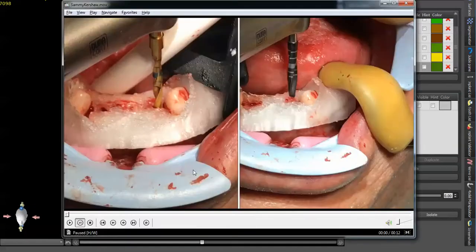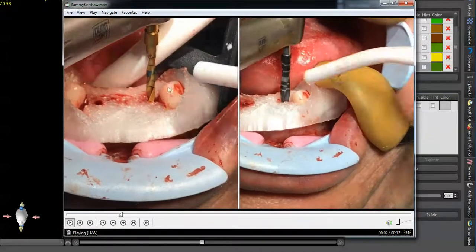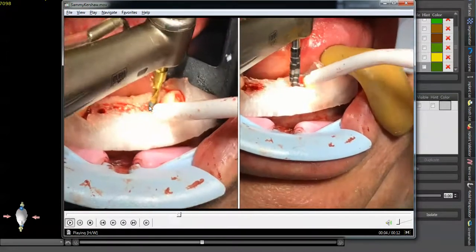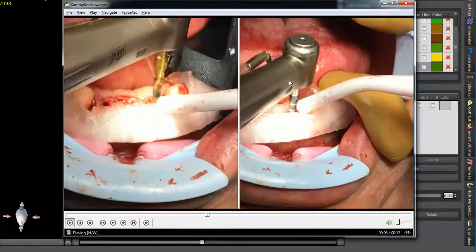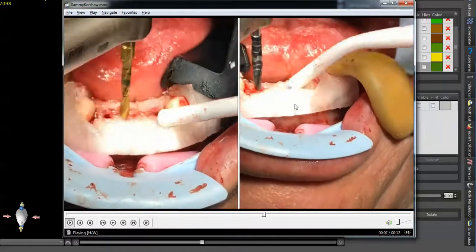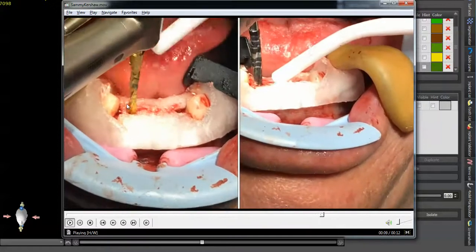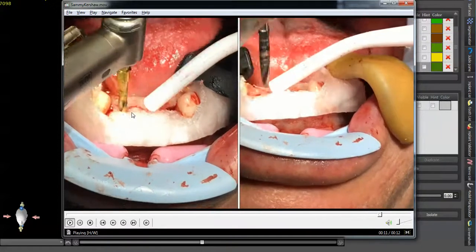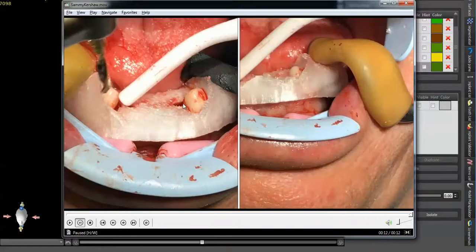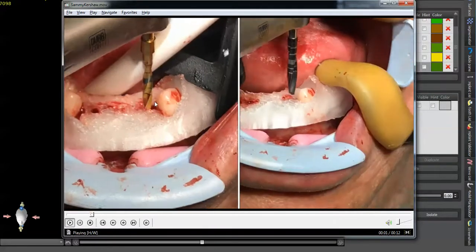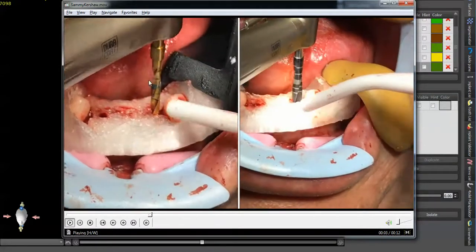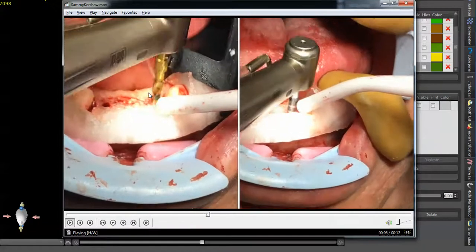What's the advantage of something like that? I'll show you the surgical video that corresponds with this. So this is the video that corresponds to the drill guide. So basically this was a 2.1 and this was the next sequential drill guide. So these are two different guides. You can see how I don't have a lot of room above the pilot drill guides. I'll replay that over real quick.